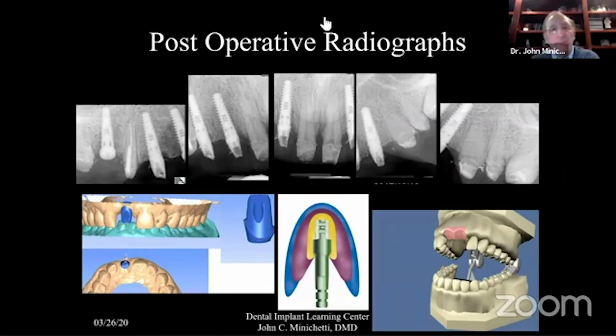Any other questions? What implants did you use and could you show the CBCT again? Were they placed with immediate loading or after? The provisionals were placed first. So the first question, let me address that, and then maybe I'll show the CBCT.